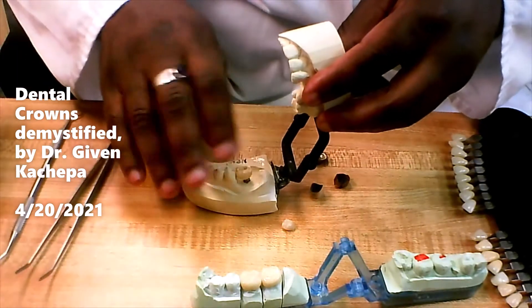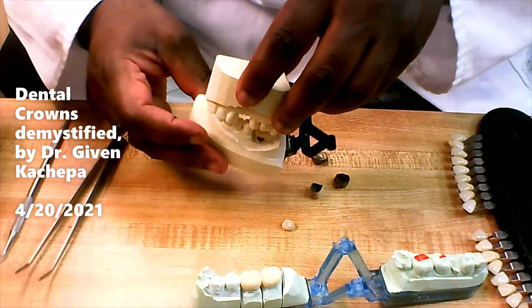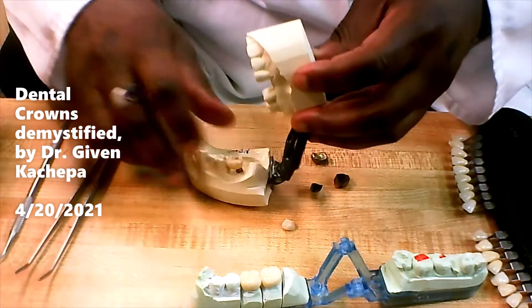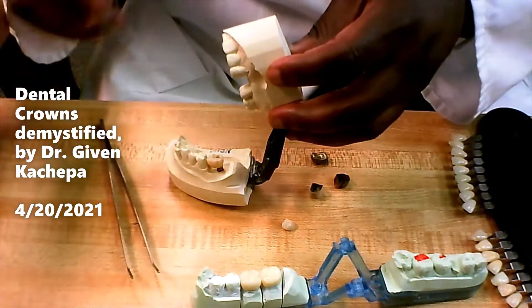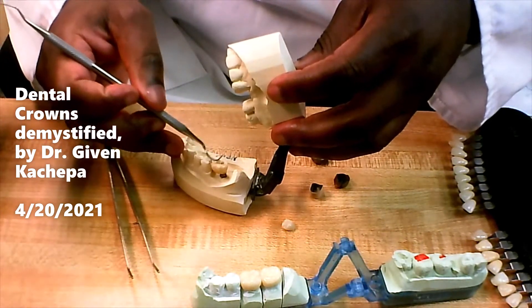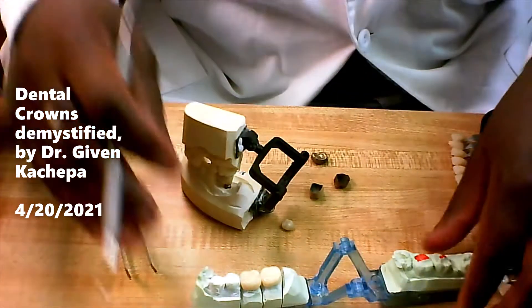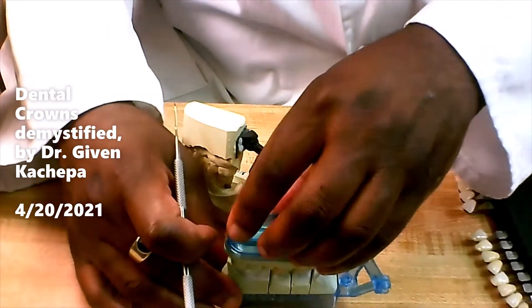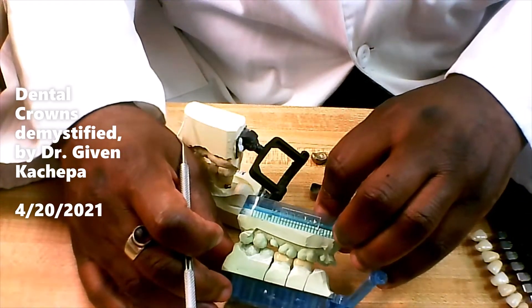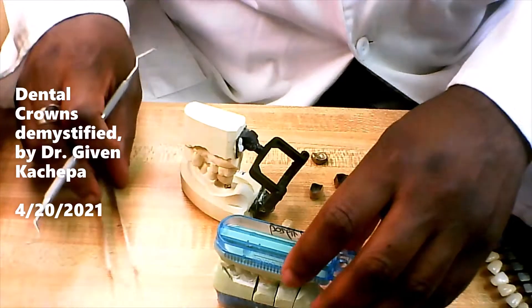When all of that's been done, you want to make sure the patient can bite correctly. As a dentist you check the bite, and we may have to adjust it a little to make sure it bites correctly. The same thing applies for a regular crown — you want to make sure the patient can bite and that it looks nice and good.